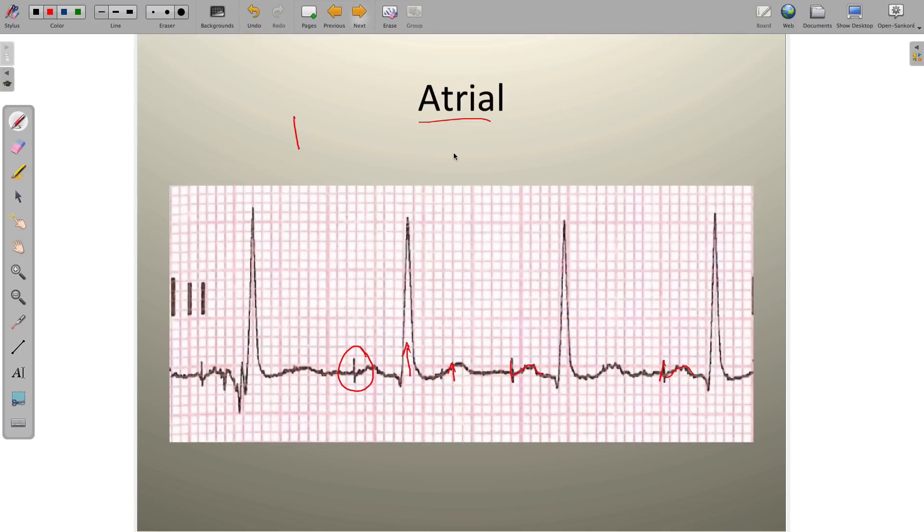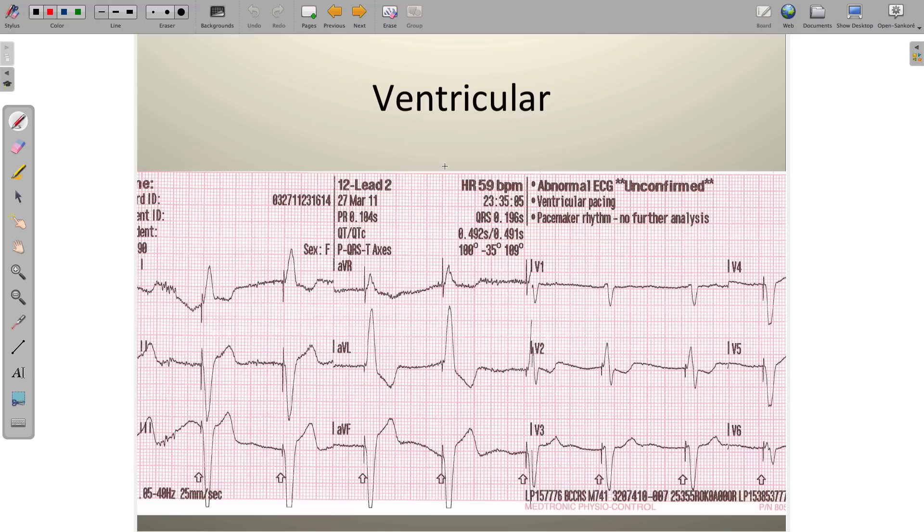The next one to look at is a ventricular pacemaker. In the case of a single ventricular pacing lead, we don't know whether it's in the right or the left ventricle. It is most likely in the right ventricle, but we have absolutely no idea.